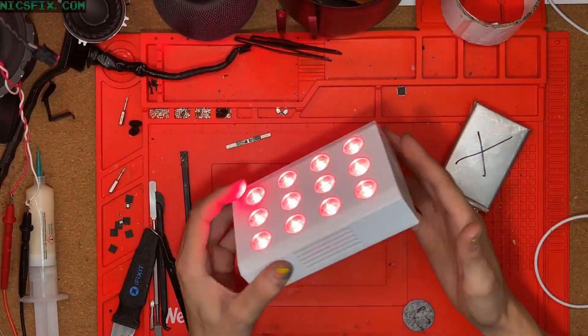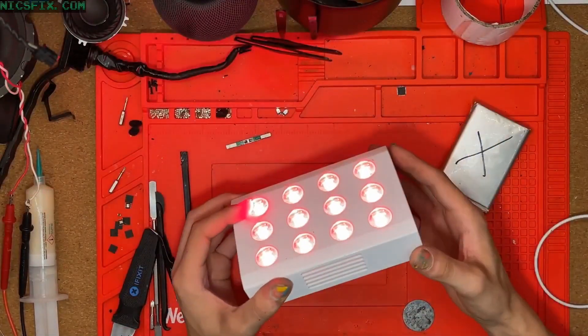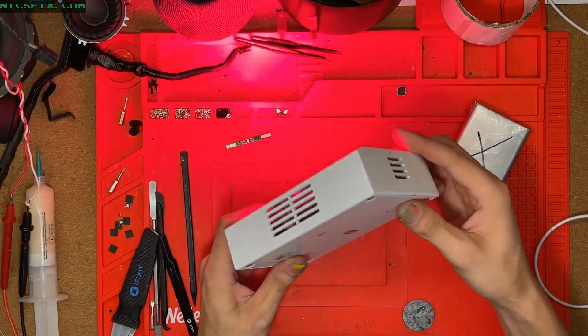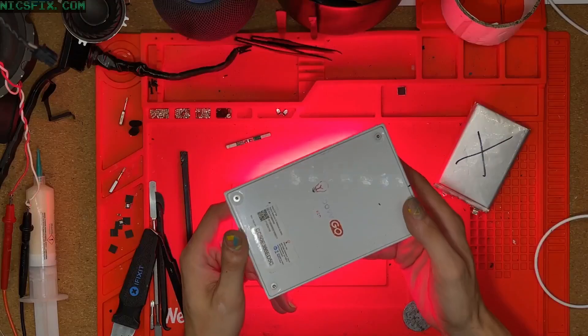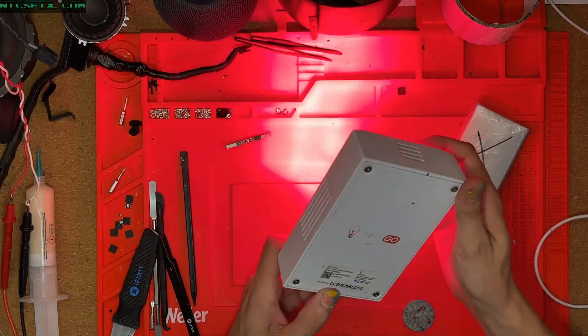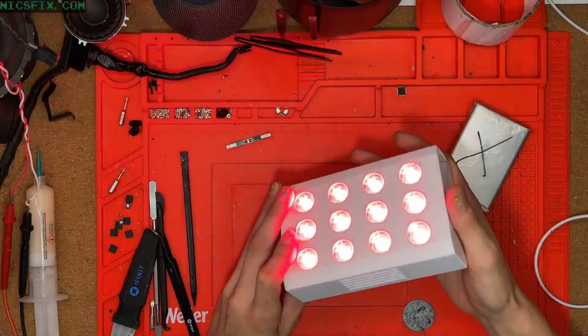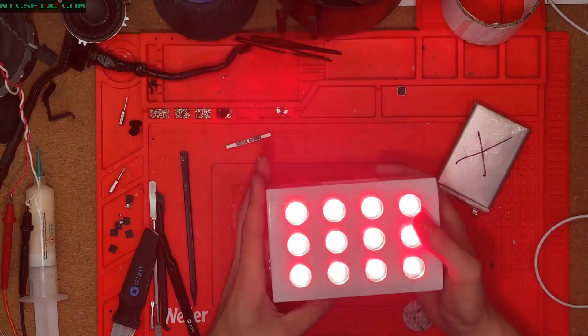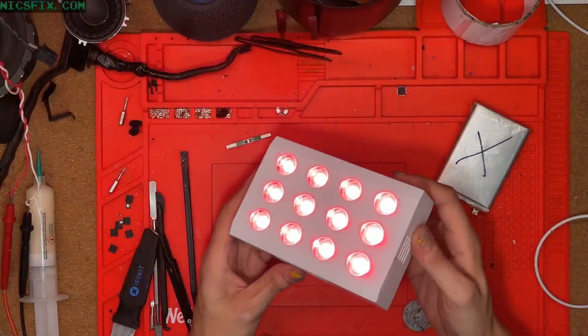How's it going everyone? I wanted to make a quick video about repairing this Juve Go Red Light Therapy device that was recently sent in to us from David.